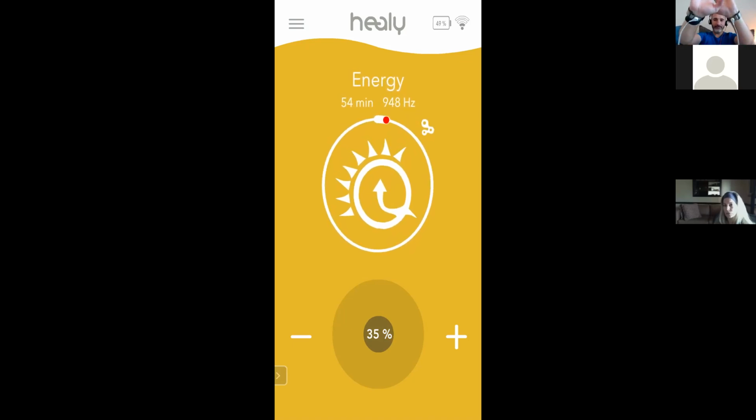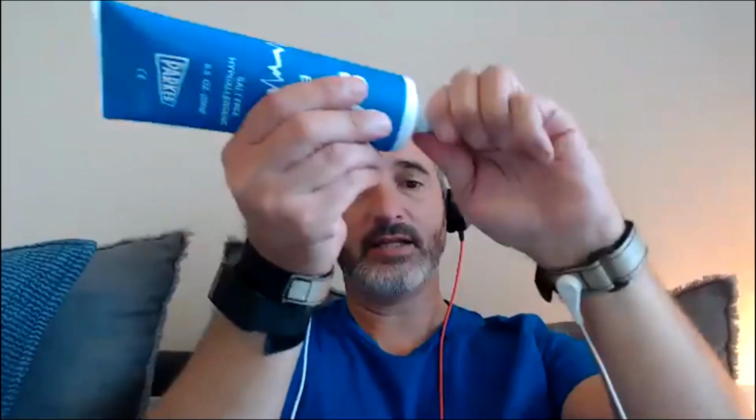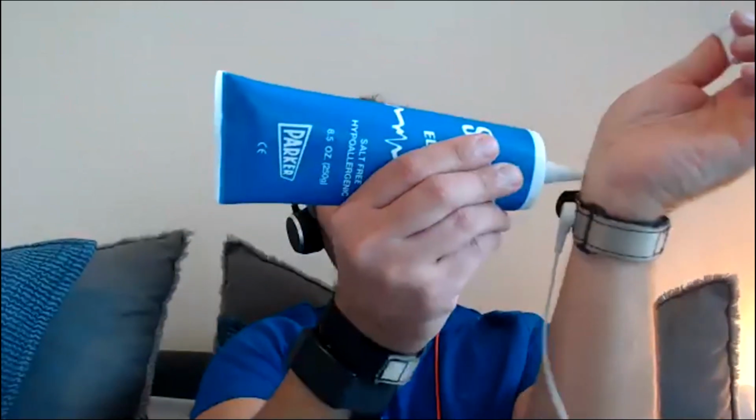So if I did all that and I was still getting connectivity issues, here's a couple things that I might do, okay? You can use water. You can put a bunch of salt in water to increase the conductivity of the water. Sometimes people take little pieces of paper towel soaked in salt water and put those paper towels underneath here. I like to use the electrode gel. It works great. So in doing that, I might just take the electrode gel and put just a little bit on my wrist here.